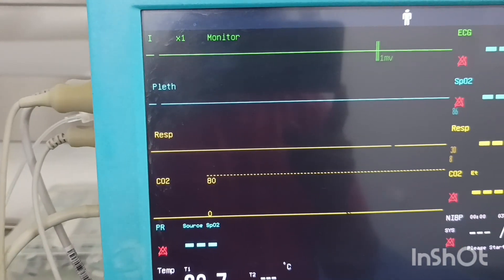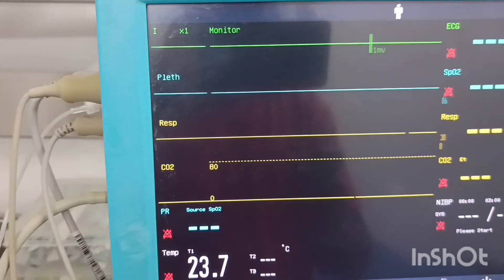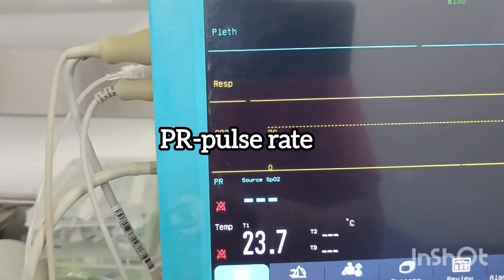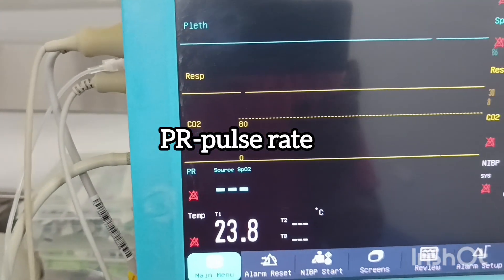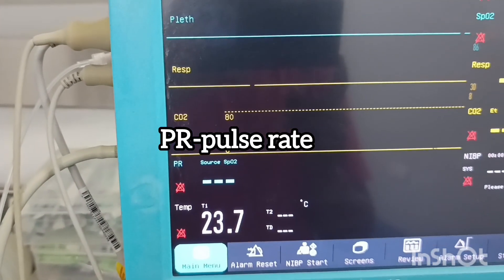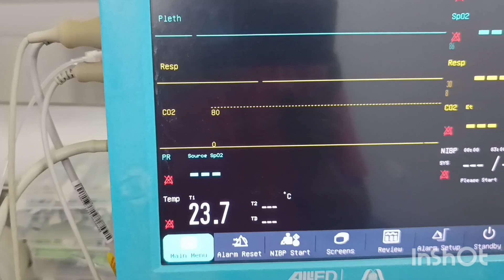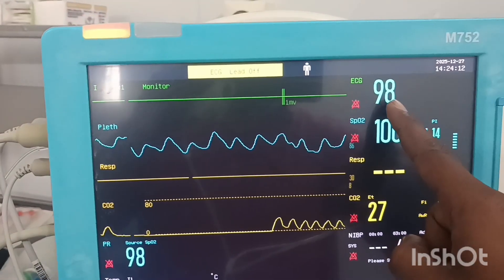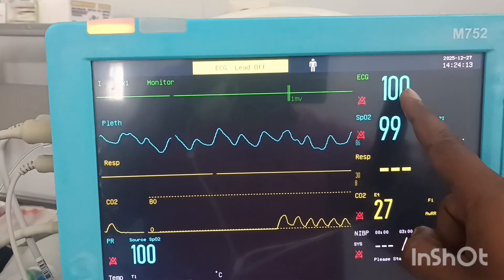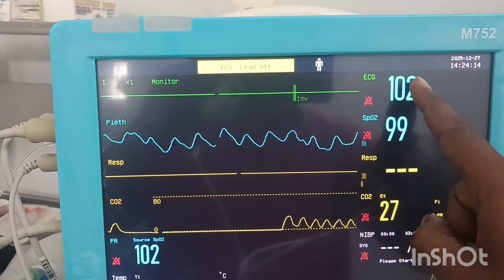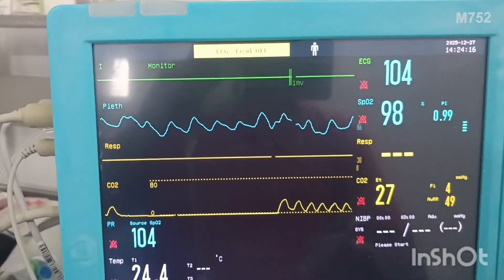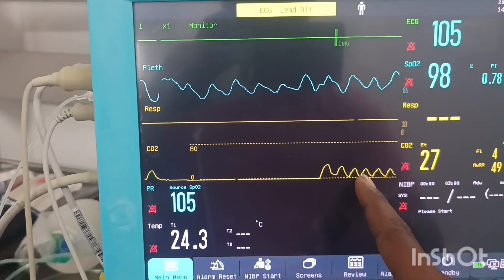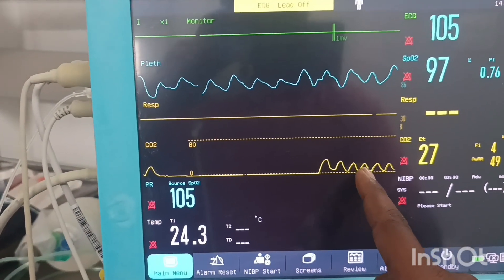PLETH stands for plethysmography — it is a medical test to analyze body abnormalities. Next is PR, which stands for pulse rate; we can check the pulse from the PR. This shows the pulse rate, this is the saturation, and this is the carbon dioxide and breathing pattern of the patient.